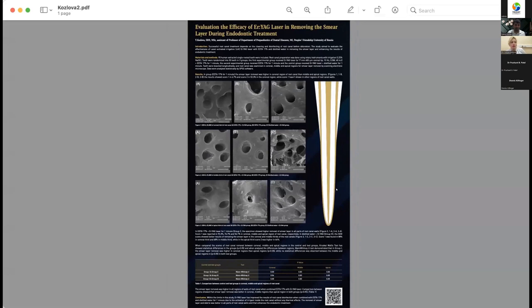And today my topic is usage of erbium lasers in endodontical treatment. So, some introduction about that. Successful root canal treatment depends on cleaning and disinfecting the root canal. So our study aimed to evaluate the effectiveness of laser-activated irrigation using Erbium YAG, which is 2,940 nanometers.